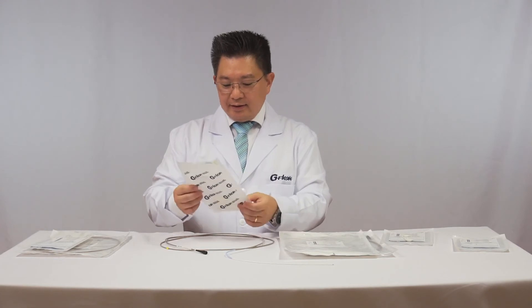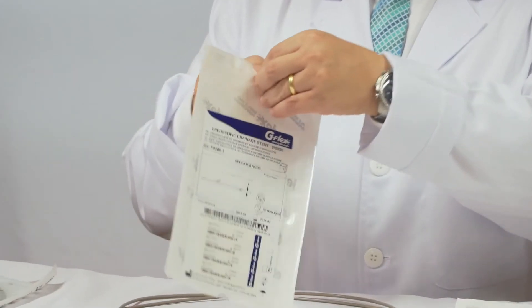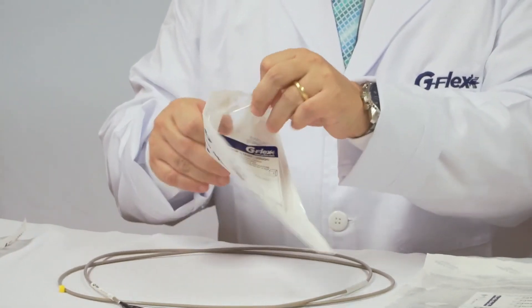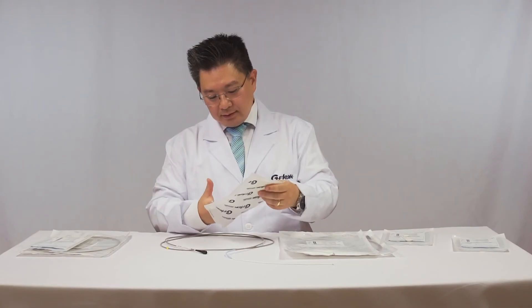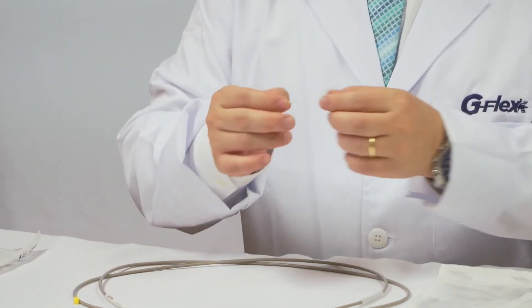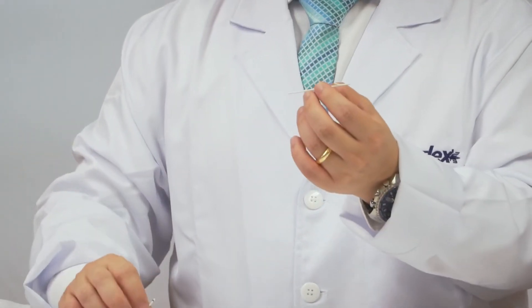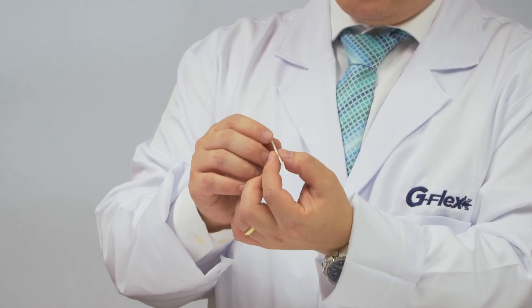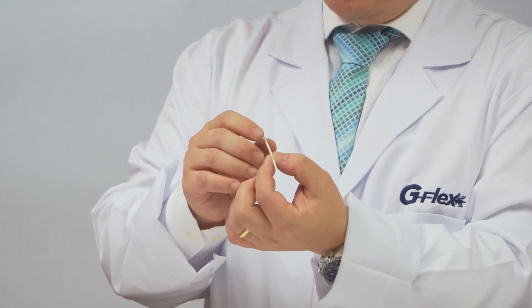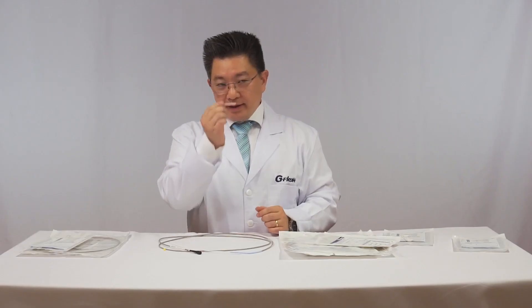The smaller size — 5 French, for example — is destined for pancreatic drainage. It's very thin, just 5 French. You can deliver the stent over the guide wire directly, with a pusher of 5 French, just for pancreatic use.